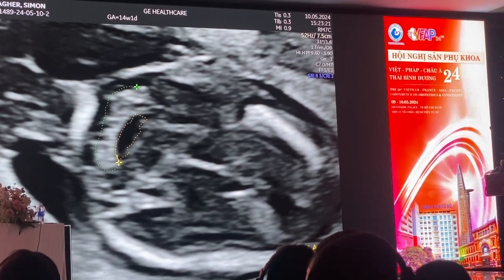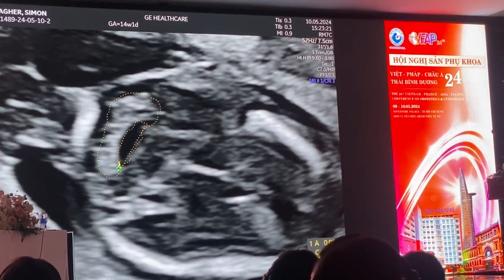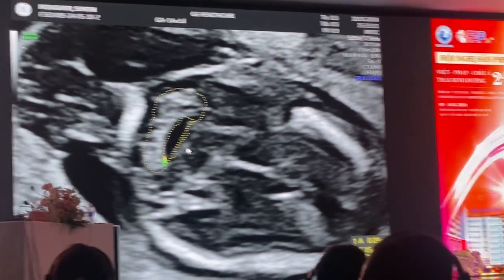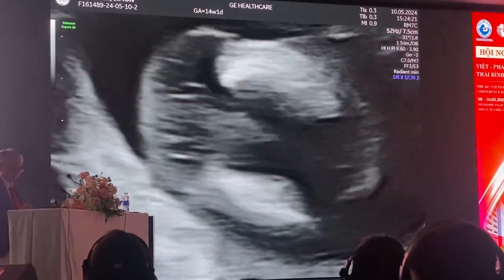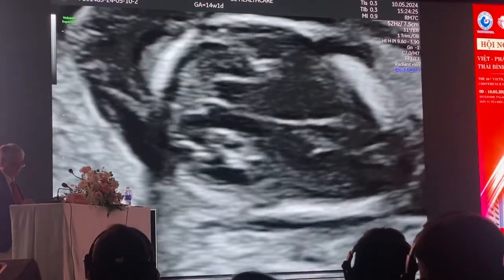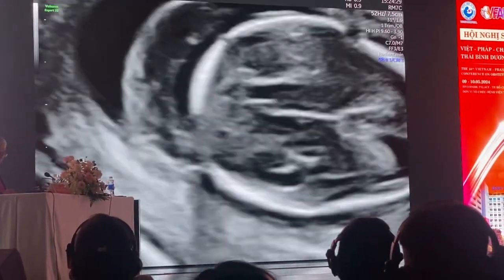So it's important for you to appreciate that anatomy, because it allows you to see the whole area of the fourth ventricle. Now for me, I much prefer to see the whole area of the fourth ventricle, because if it's dilated, I like seeing this in an axial section because I can see the whole chamber of the fourth ventricle, not just a single mid-sagittal section.